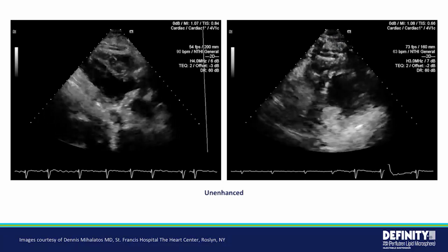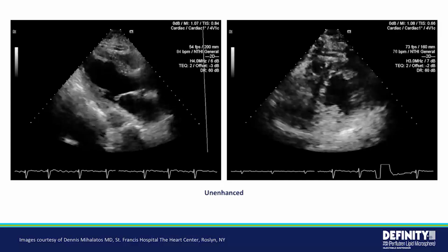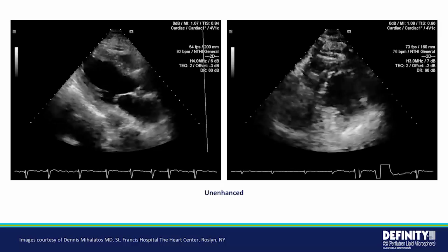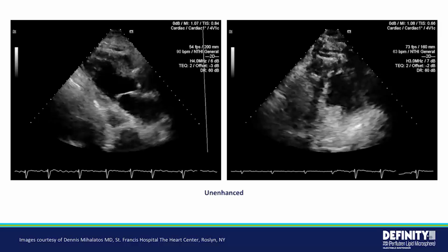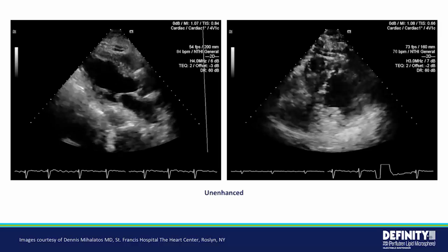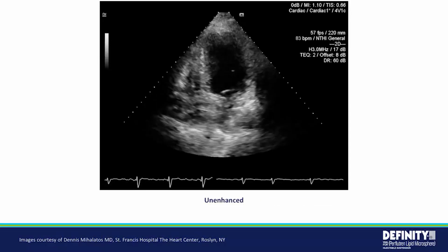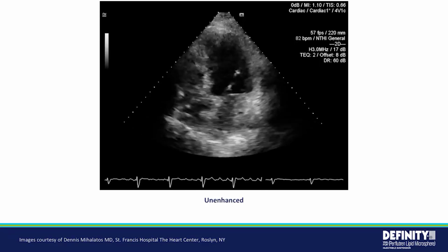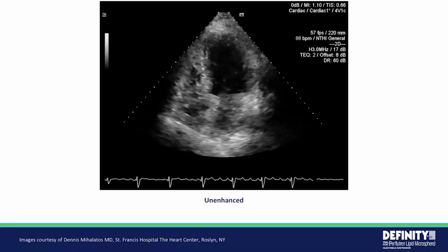These are the images that we can see, and obviously we can see some significant diminution in ejection fraction. You have reasonably well seen endocardium in the parasternal long axis, some of the lateral wall missing on the short axis. And furthermore, on these apical views, these are our Achilles heel. We're missing the apex and we're missing the lateral wall.